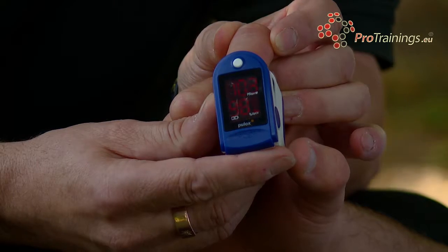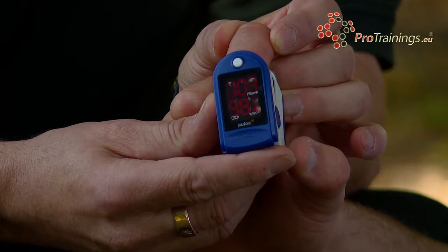tourniquets, even BP cuffs. We never put a pulse oximeter on the same arm where we put a BP cuff, because as you blow the BP cuff up, you cut off blood supply, and with blood supply gone, you're not going to get an accurate reading whatsoever. So we then get a reading onto the actual monitor itself, giving us an oxygen saturation between 95 and 98.